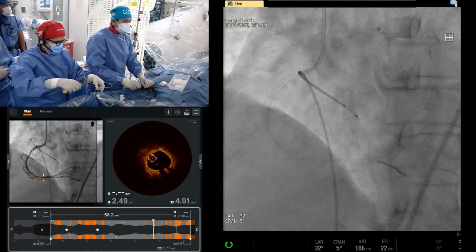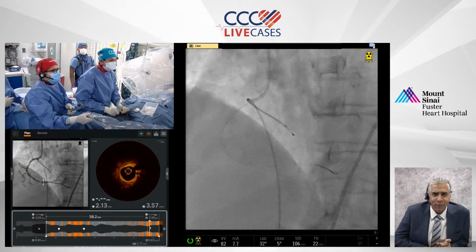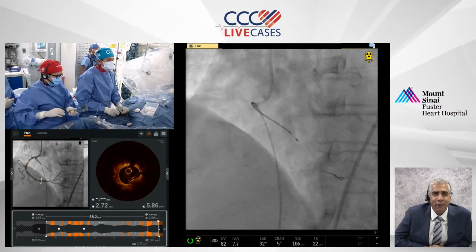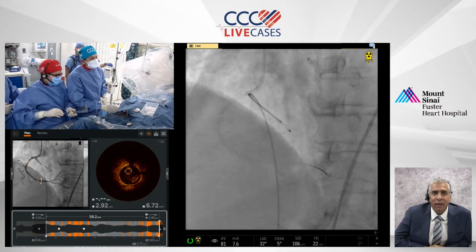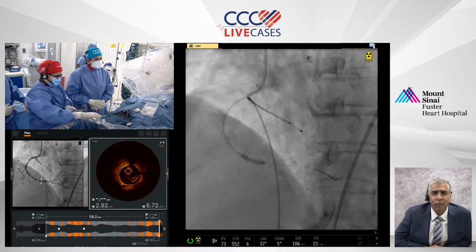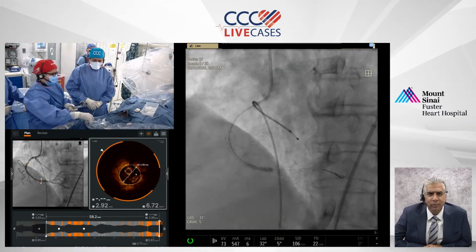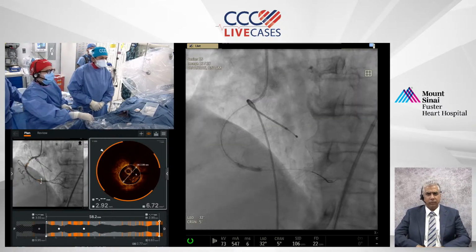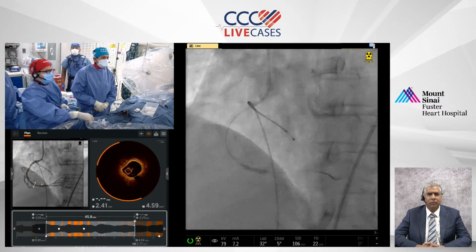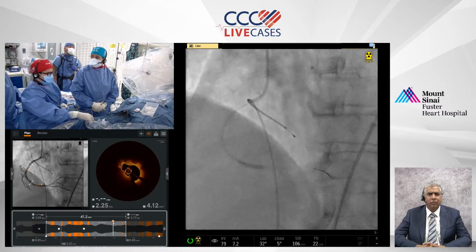I like the IVL idea. I think that while it didn't exceed 270, there are certain segments. That distal segment to me is bothersome. Yeah, the burden, thickness, and length. And another very important thing about IVL is look here, 4 atmosphere. You see that? Wow. So we are going in. 120 pulses there. That's number 1. Number 2, the rotor wire is still by the side. Look at that. I think you needed it. Now it opened up.